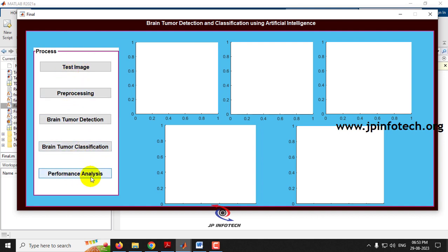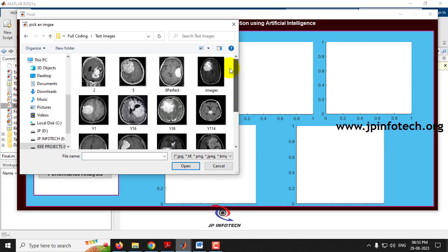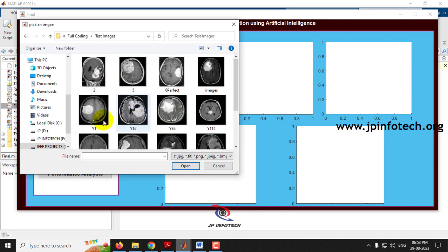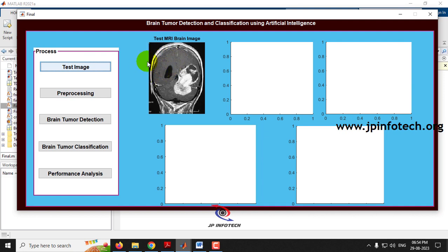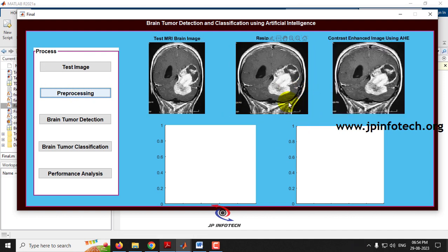The GUI shows the process steps: test image selection, pre-processing, brain tumor detection, brain tumor classification, and performance analysis. First, select a test image — you can choose from the test images or train images folder. After selecting an image, it is previewed. Click 'Pre-processing' to see the resized image and contrast-enhanced image using AHE (Adaptive Histogram Enhancement).